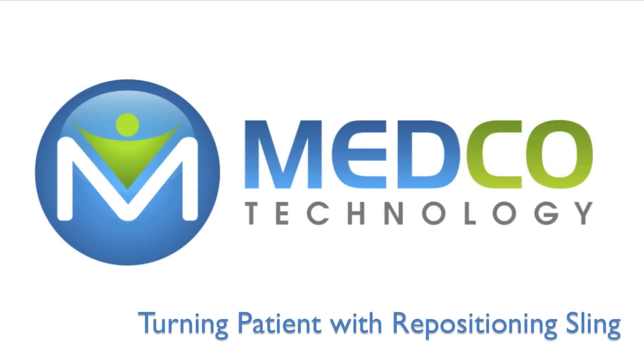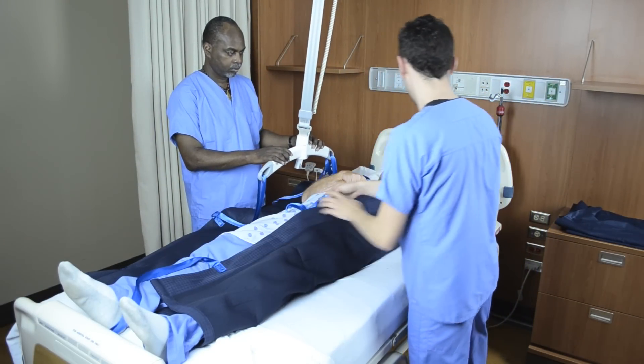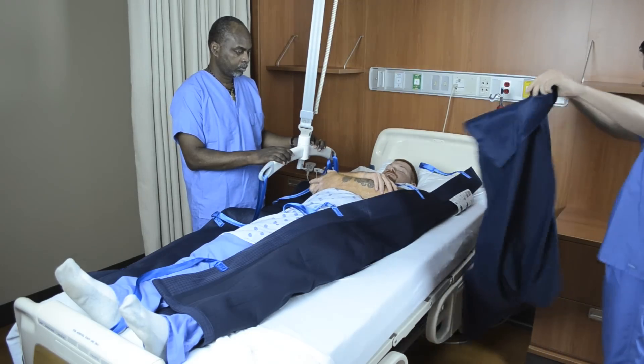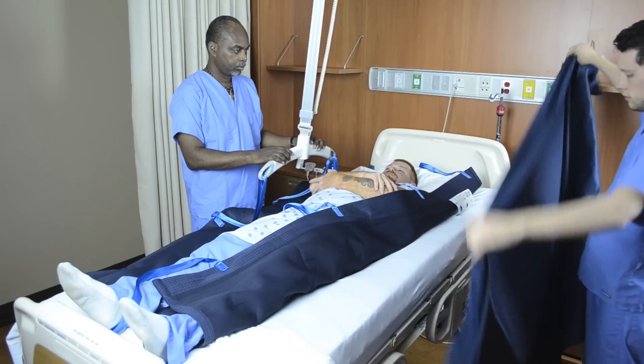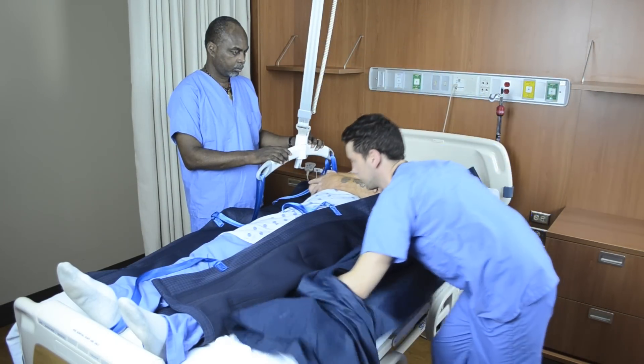To turn the patient using the ceiling lift and repositioning sling, take a smart slide sheet, fold it in half, and tuck under the repositioning sling toward the midline of the patient's body. The smart sheet should be tucked under and doubled over to ensure there are two layers.